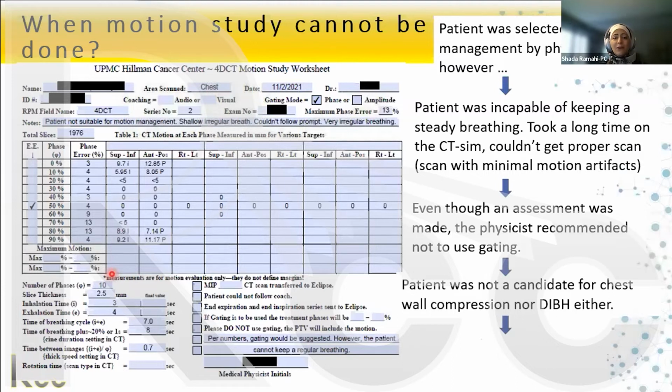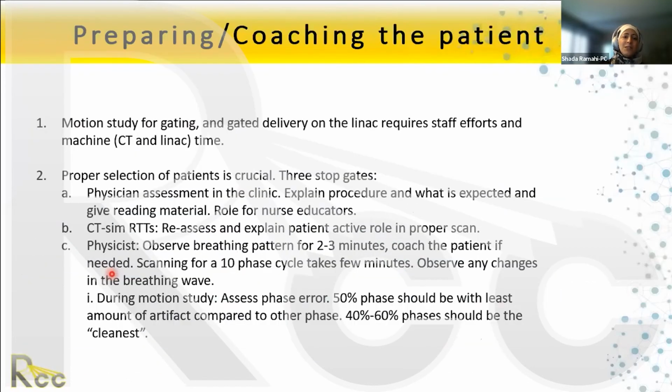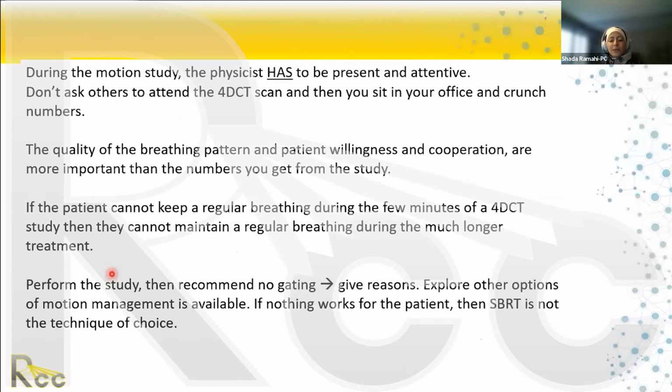The computer will give you an output. If you know this concept from computer science, it's called GIGO, garbage in, garbage out, right? You'll get numbers, but you have to be there to see how the patient is performing. If you need to stop the scan and go inside the room, coach the patient again, maybe they're fearful, maybe they're not relaxed for whatever reason. Perhaps it's time to put in the audio coach, the breathe in, breathe out coaching that they hear. You have to make sure that you have given this patient all the chances they can get to have a good scan.